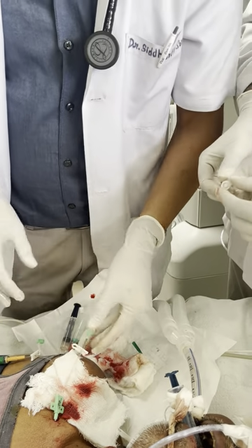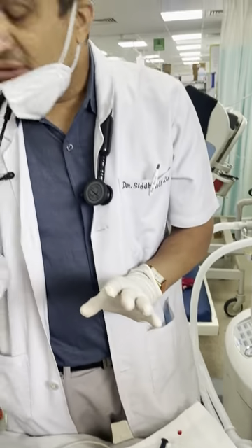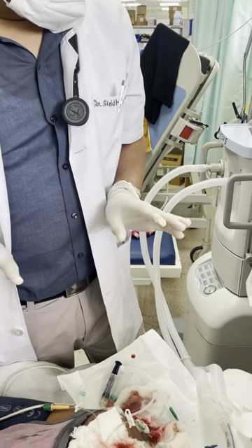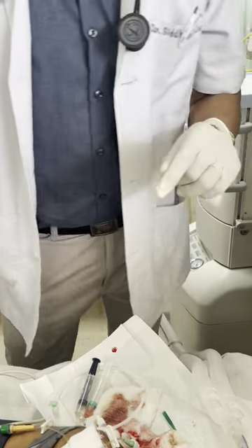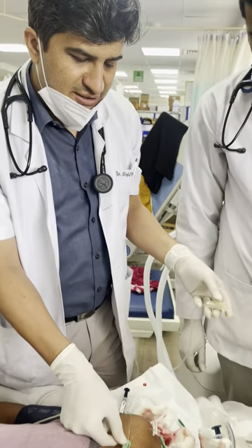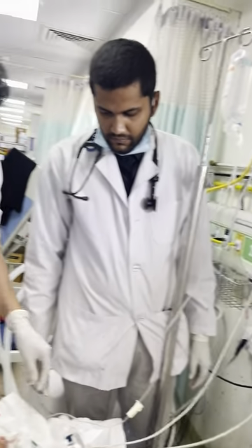And one more thing, you have done this, you have heparinized the line, but still, you should immediately attach one fluid, okay? Immediately attach, then stitch it. Ideal approach is, sister, you give fluid. Patent. That is a big challenge. Now we are damn sure that it is going through. Chalo.